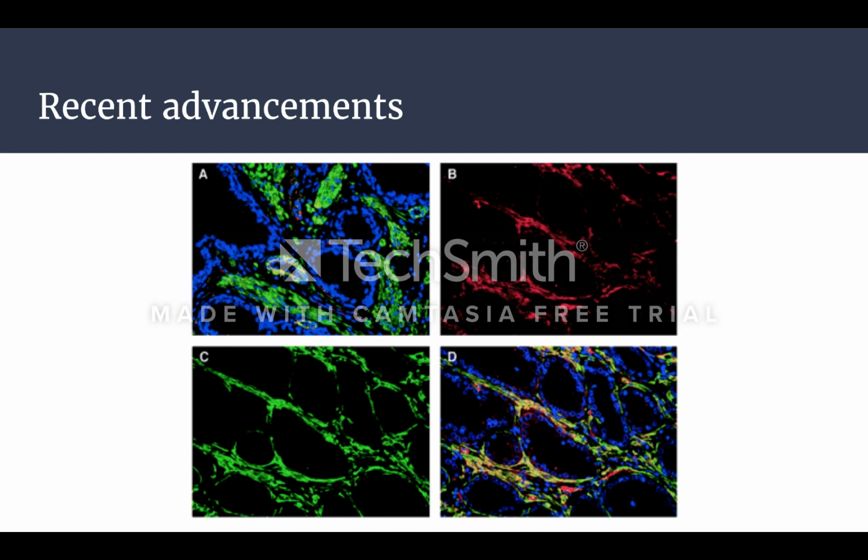Here, myofibroblasts and prostate cancer can be seen. These images show the different biomarkers that a tumor contains. This is an example of how immunohistochemistry recently advanced to allow for more information when analyzing samples.